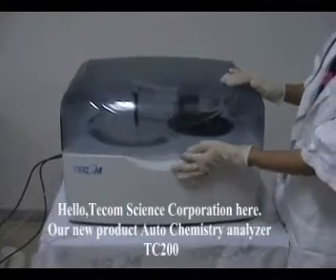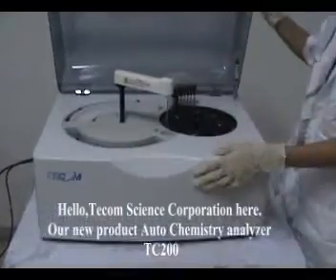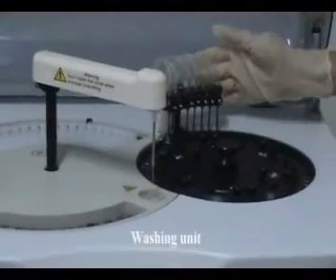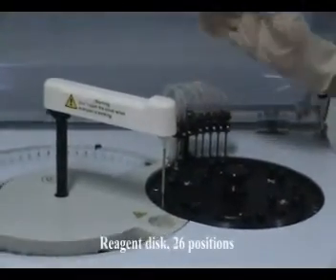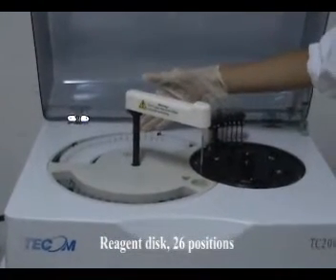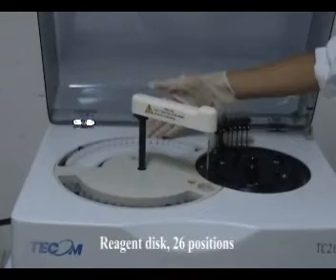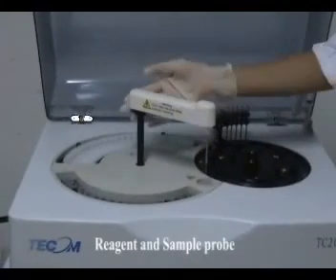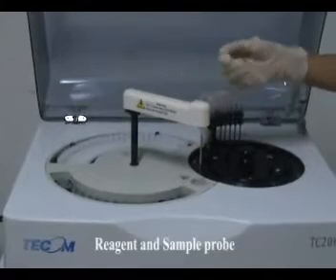Take on new product: auto chemistry analyzer TC-200. Reaction disk: 60 positions. Washing unit. Reagent disk: 26 positions. Sample disk: 18 positions. Reagent and sample probe.